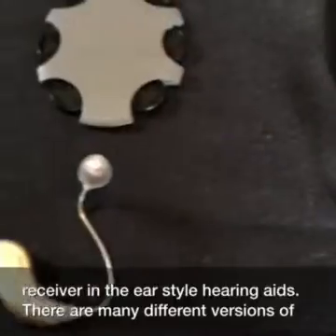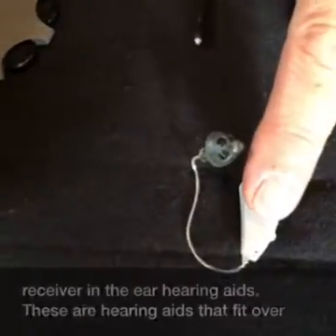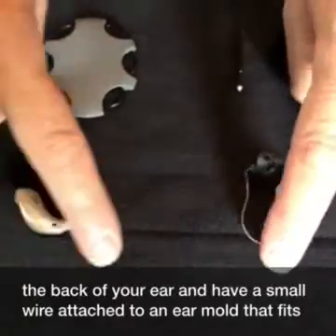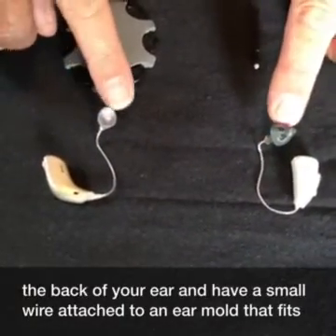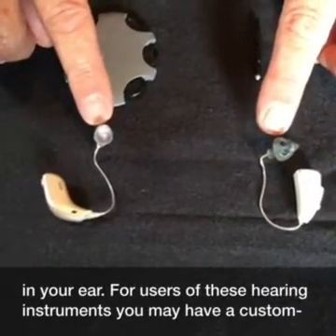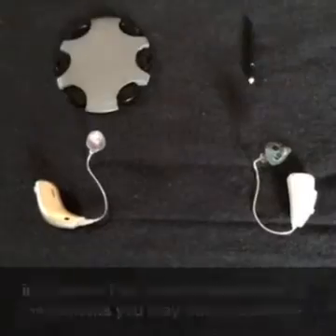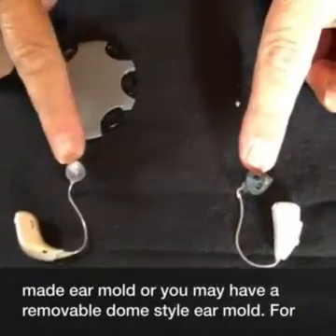There are many different versions of receiver in the ear hearing aids. These are hearing aids that fit over the back of your ear and have a small wire attached to an ear mold that fits in your ear. For users of these hearing instruments, you may have a custom made ear mold or you may have a removable dome style ear mold.